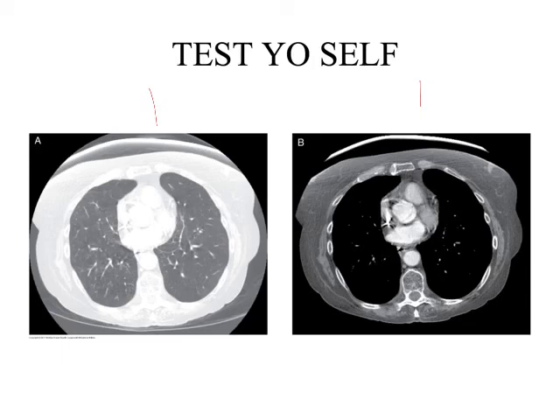Another thing that's interesting about this image, and I want to point out to us because this is very, very significant to us as radiation therapists, two things really. Number one, this patient's probably been shielded with a breast shield, right? So there's some kind of cadmium or some kind of breast shield put in place, and they do this quite a bit in diagnostic imaging now. They're trying to reduce surface dose, right? Particularly to areas like the breast.